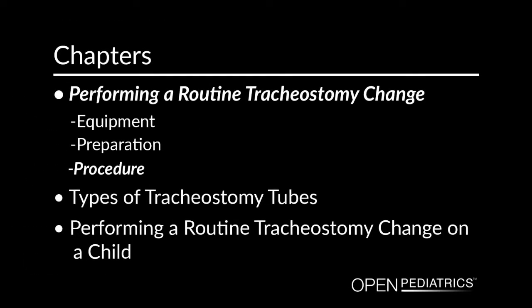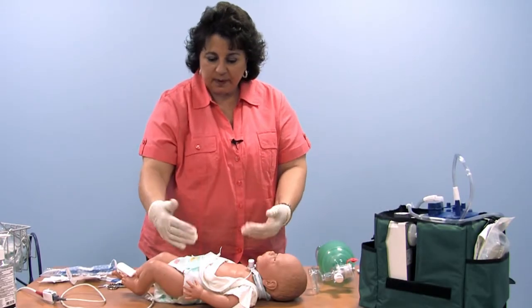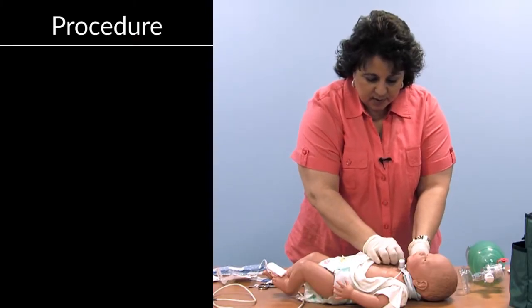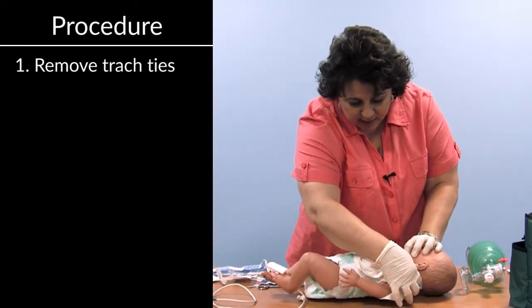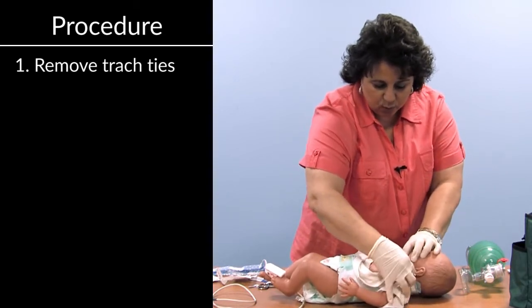Performing a routine tracheostomy change procedure. So you must sort of imagine that I've got two people here. The child has been papoosed. The neck is exposed. We're going to remove the old trach ties, and kids don't like your hand over their eyes like I'm doing right now. Remove the old one.